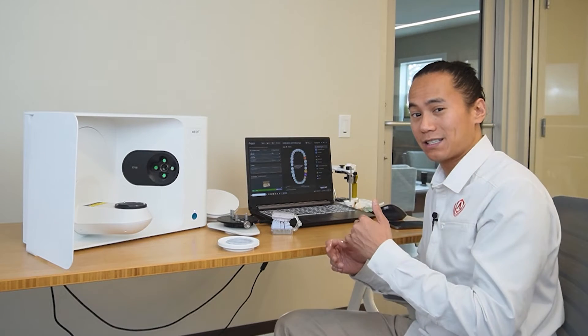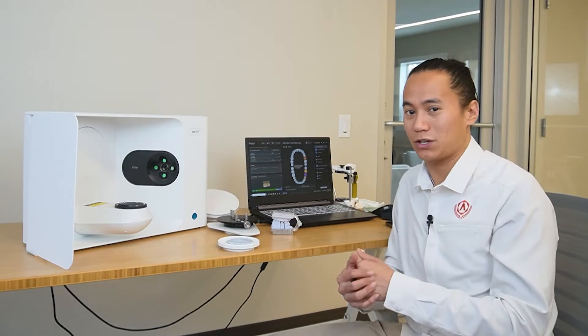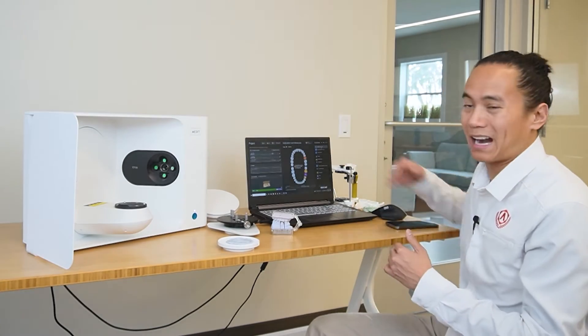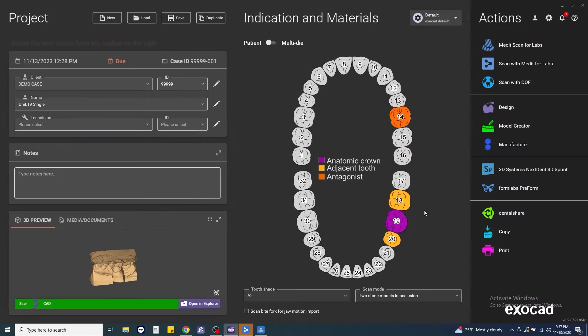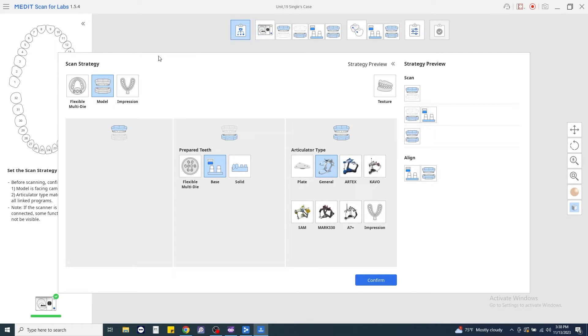ExoCAD automatically detects that the Medit Link application is installed on your computer. And it'll automatically give you that icon on the screen. So once we have the case set up here, we'll go ahead and click Medit Scan for Labs. So once we've had our case set up, we're going to go back here for Medit Scan for Labs and go through the scan strategy.